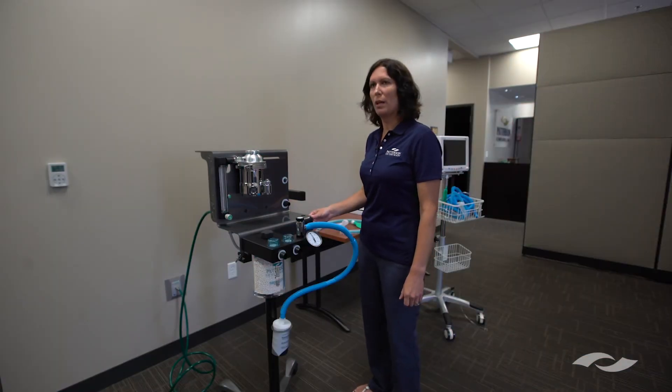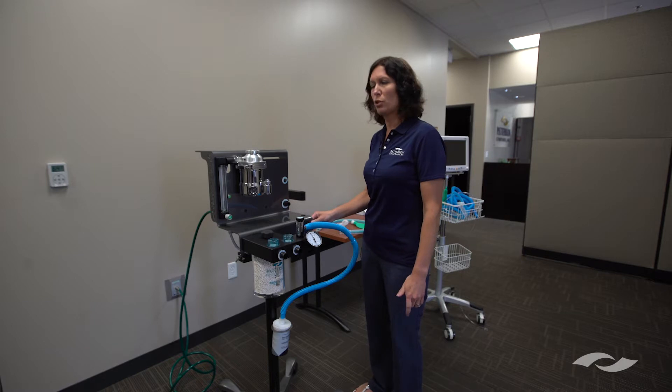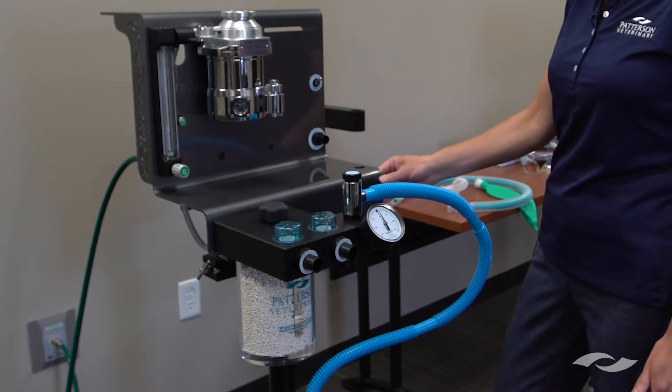One of the most common questions we get on the anesthesia and monitoring hotline is how to do a pressure test, or in other words check for a leak. This machine here is our Patterson Versa 2 anesthesia machine.